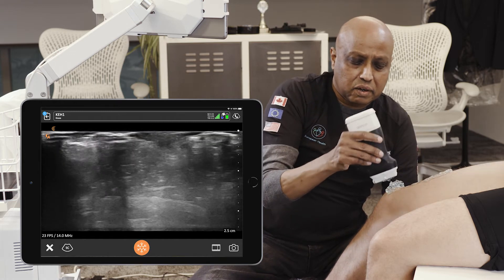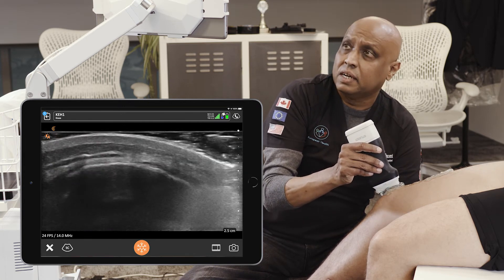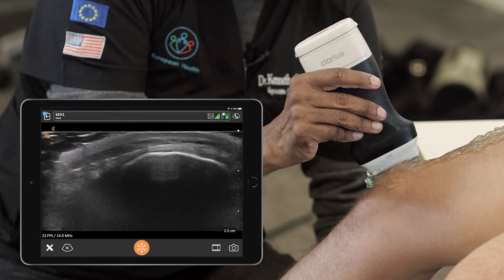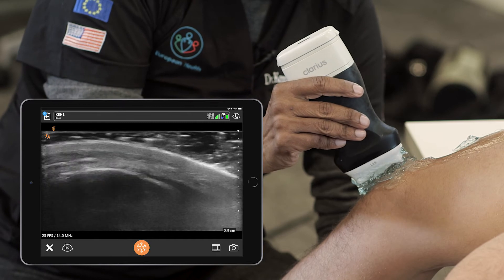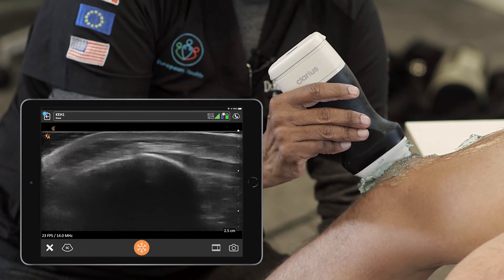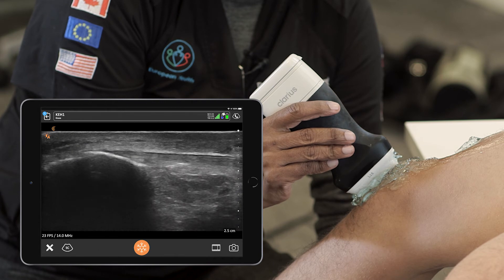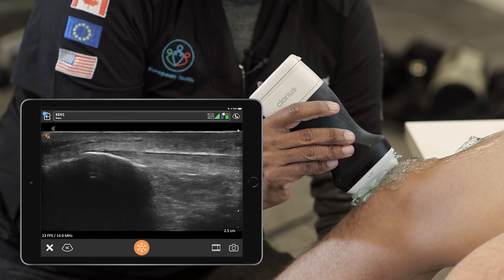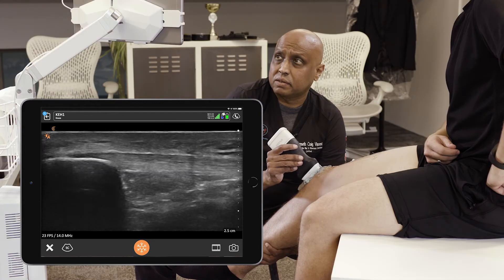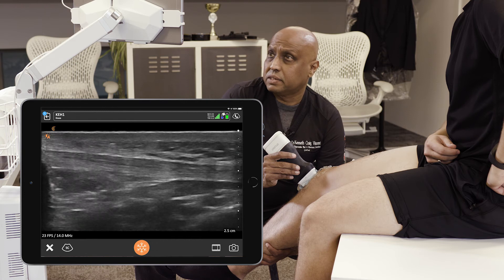I am now going to go onto the superficial structure of the patella itself. I'm going to use a technique which we call floating, where there is no contact but the probe sits within the gel. We start to see the various structures. We can see some sign of old injuries, and we now see a very nice pattern of the patella. Given his long career in skating, this is a healthy tendon with a good pattern, good fat pad position, and no signs of overt pathologies of the bursa.